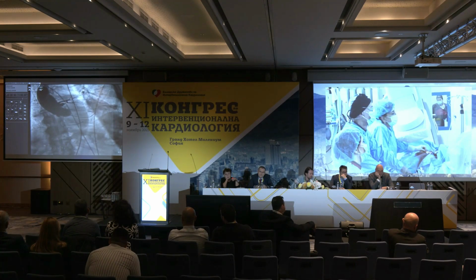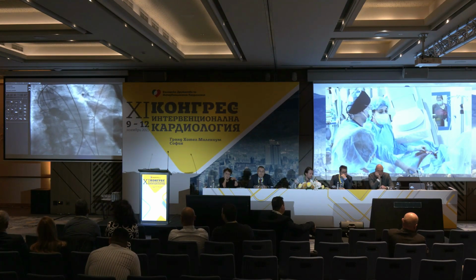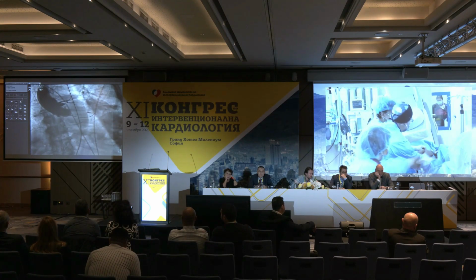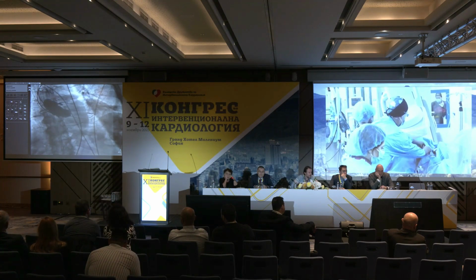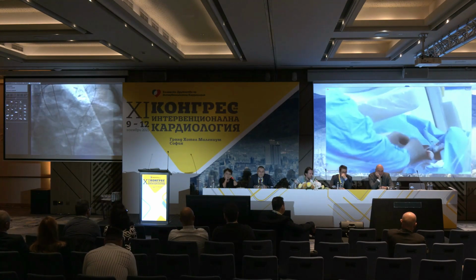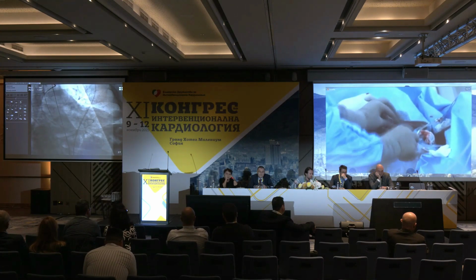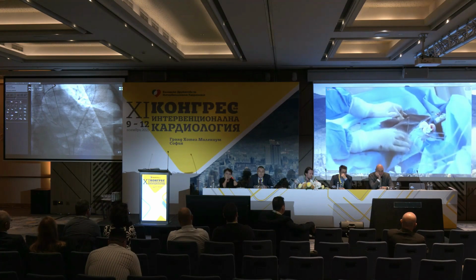So the next step is to go with the valve system. We check the valve; it's okay as a crimping. So we are going to remove the 14 introducer from the femoral artery, and we will now go with the valve system.